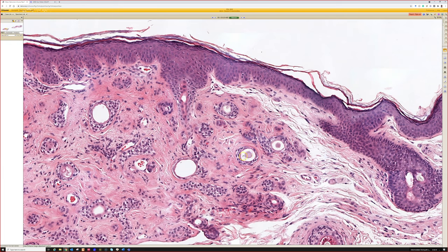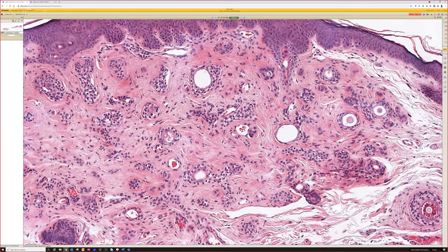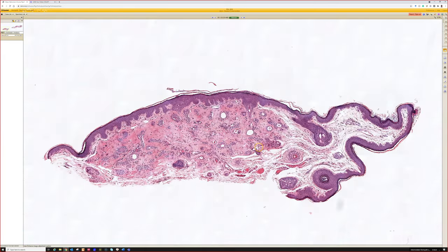Sometimes they look round like a little circle or a donut. Other times they have the little tadpole shape with the tail. And look at the difference here from low power. This is eyelid skin, right? See, I told you it's very loose and edematous eyelid skin. And then here, all of a sudden, you have this very, very dense sclerotic pink collagen in the background, and all of the little ducts and tubules of the syringoma are embedded in that in their own discrete sclerotic stroma.